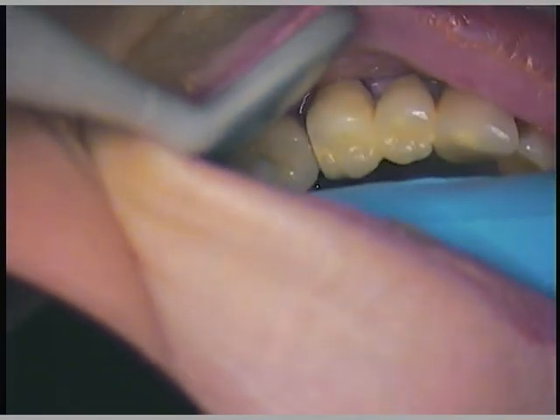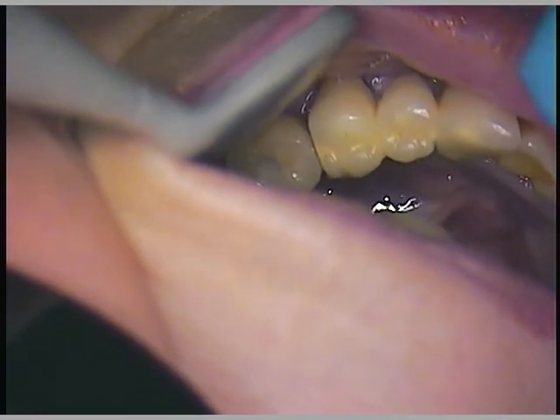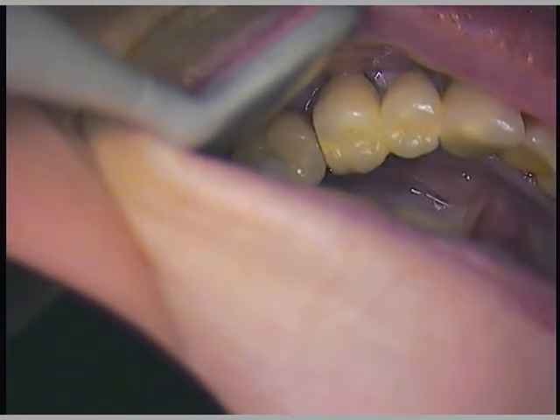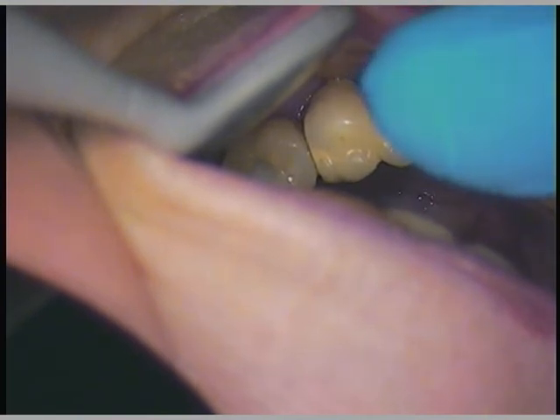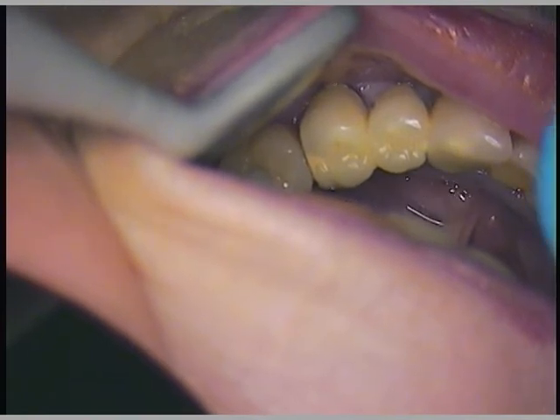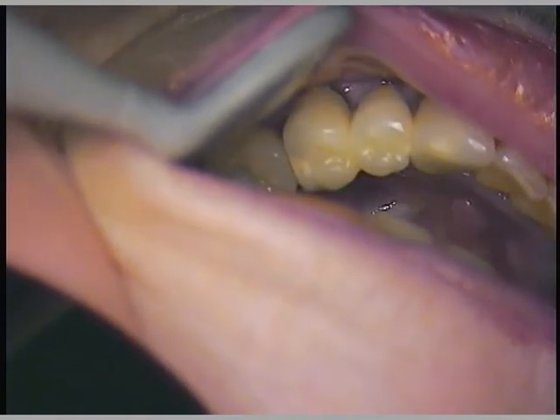One of the ways we're going to do it is to first secure the crown — that's the first and most important step. The next thing is to clean out the access hole, go in and identify the head of the screw, and find out how bad it is and what we can do. Sometimes we can slot it and place a smaller screwdriver in there. Sometimes we have to place a small dimple and then use another driver to unscrew it. The third possibility is we just go in and grind it and then it comes out.